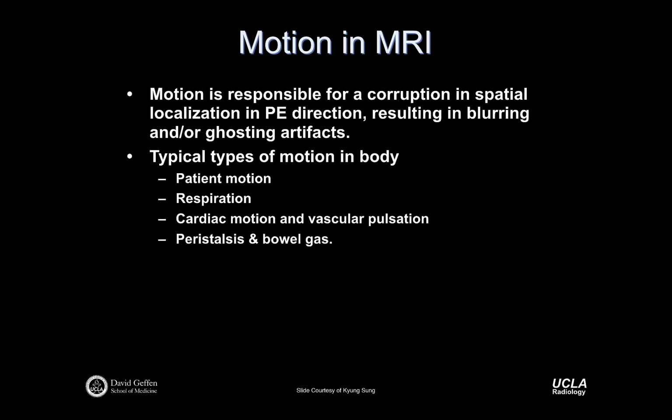But it's typically a very aperiodic form of motion, right? If they move, if they cough, if they sneeze, if they scratch, those are things where you don't know when that's going to happen, right? And so that can make it tricky. You can sort of coach it, but when it happens, it's not exactly predictable.